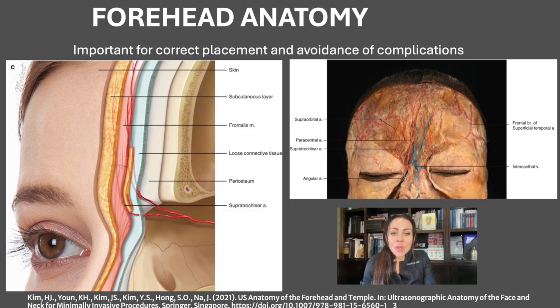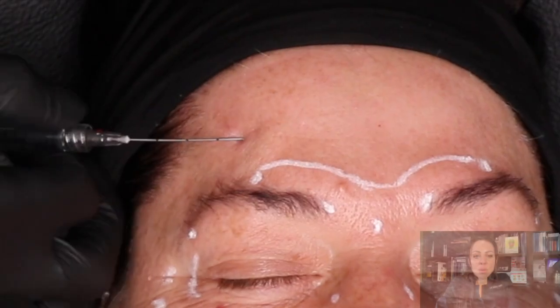When doing forehead fillers, it's very important that we are underneath the frontalis muscle, which is the safer plane to be in. This is also the plane where we are far away from the vessels. At all times we are going to use a cannula to reduce the risk of any vascular accident.